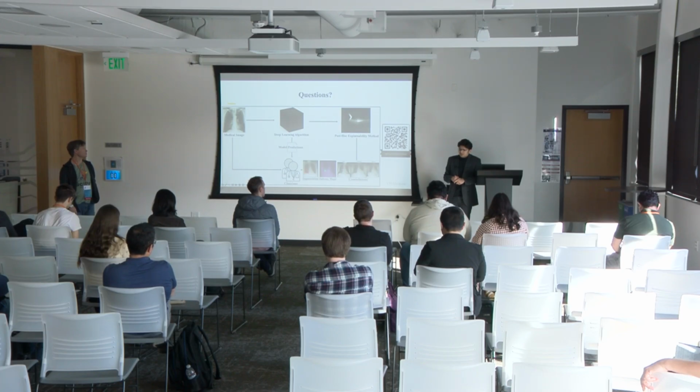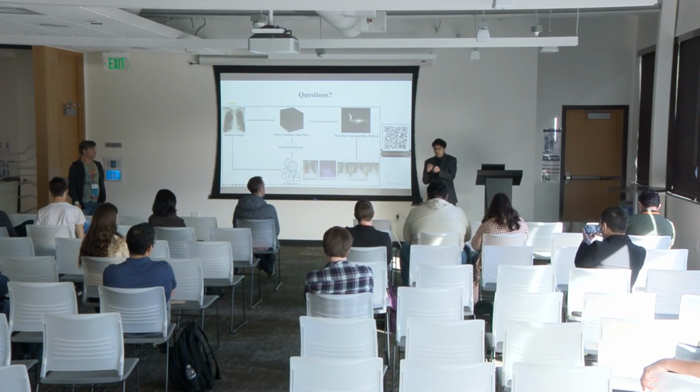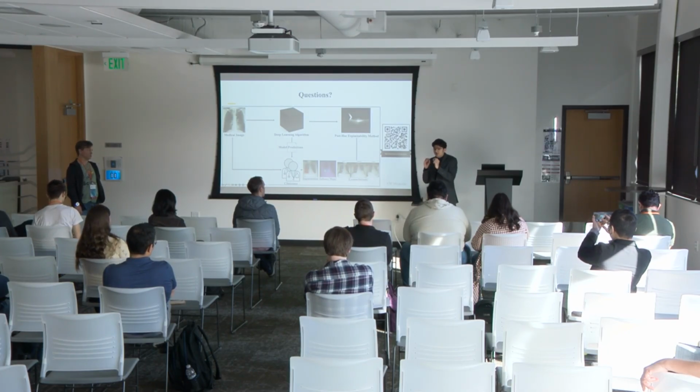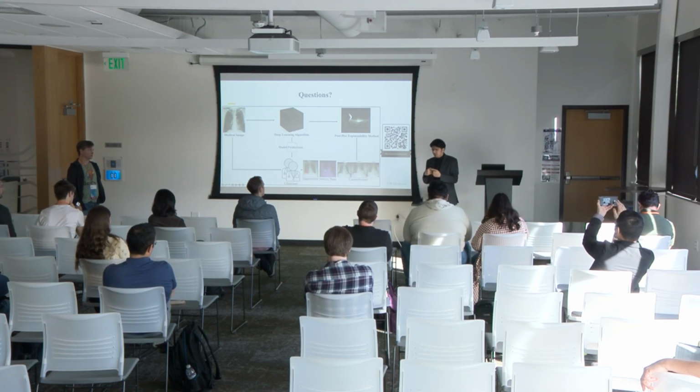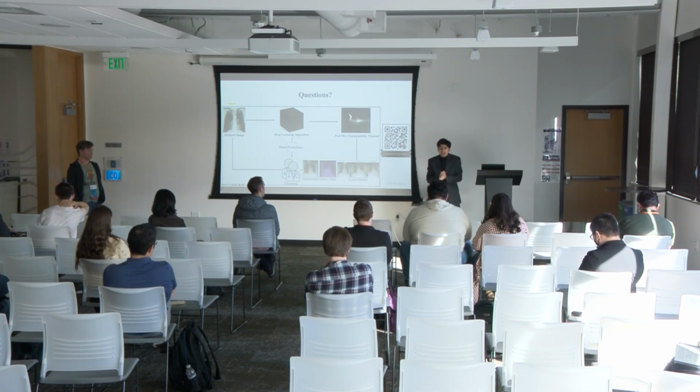So I guess one of the most important aspects of explainability is not just to defend or advocate for our deep learning models to clinicians or radiologists, but to also help our own targeted fine-tuning efforts. For example, if a company knew that their model is underperforming on such and such edge cases, they would like to have better mechanisms to understand the reasoning behind those specific predictions, which in explainable AI we call local explainability, so that we can understand where the model went wrong.